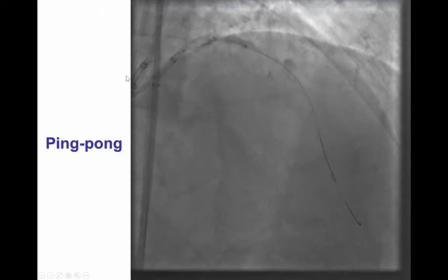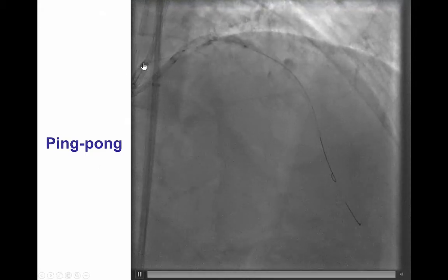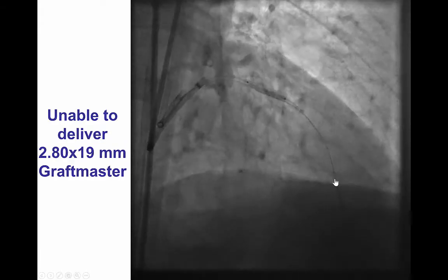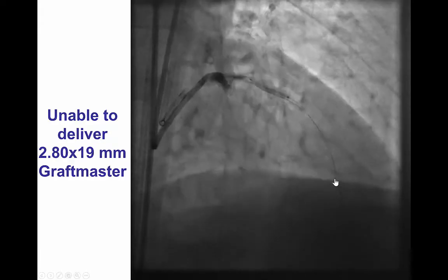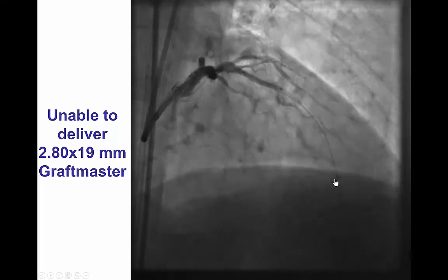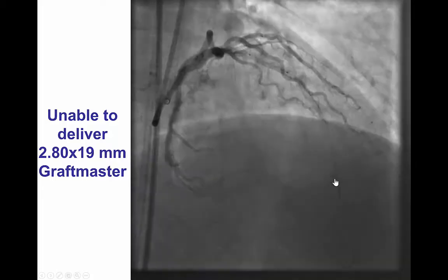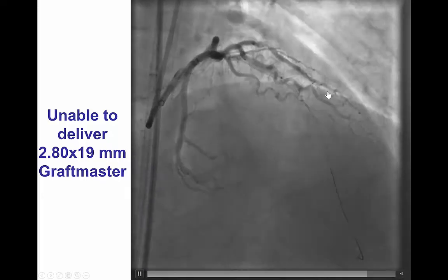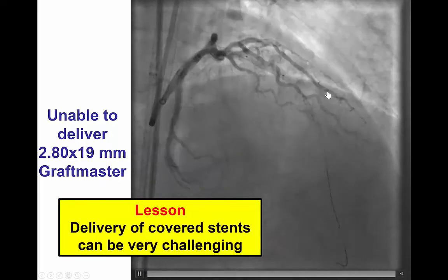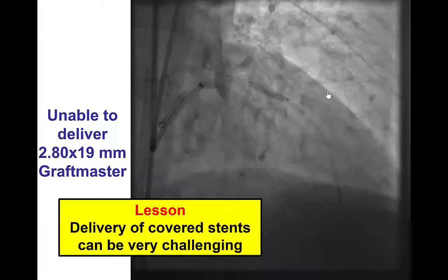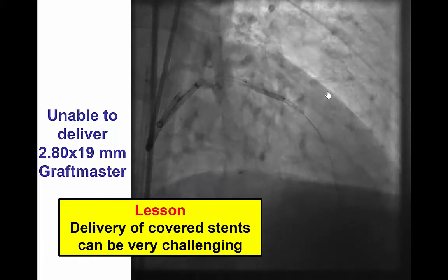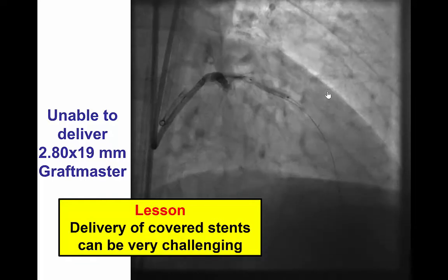That's exactly what was done in our case. A second guide catheter was advanced after pushing back the initial guide catheter, and during transient deflation of the balloon, a second guide wire was advanced to the mid-to-distal LAD. However, JoStents can be fairly bulky and difficult to deliver, and that was exactly the case in our patient. Despite having the balloon there to act as a distal anchor, we could not deliver the covered stent to the site of perforation. In Europe and other countries there are different stents like the Papyrus which are much more deliverable. However, in the U.S., the only stent approved under the humanitarian device exemption is the JoStent.